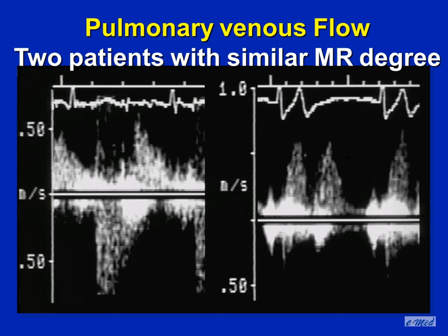Either the whole left atrium has a V wave because the pressure is elevated, or the jet hits the wall close to the venous orifice, and it creates a local V wave that produces the reversal. This is why you can have an asymmetric reversal when you do TE, that not all the veins are with a reversal.